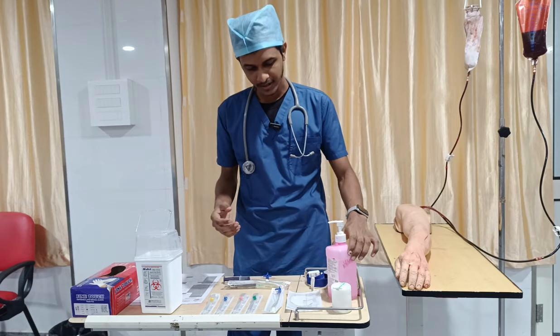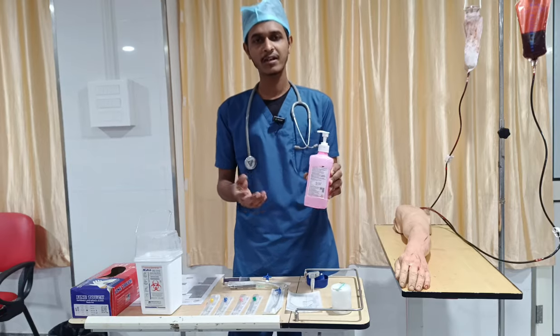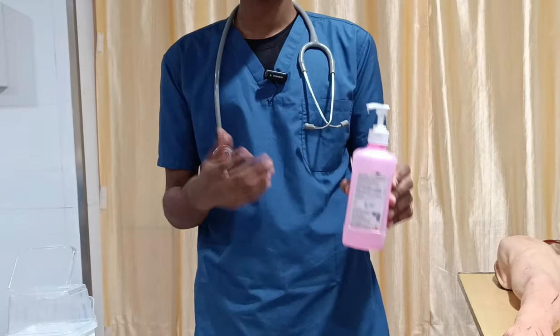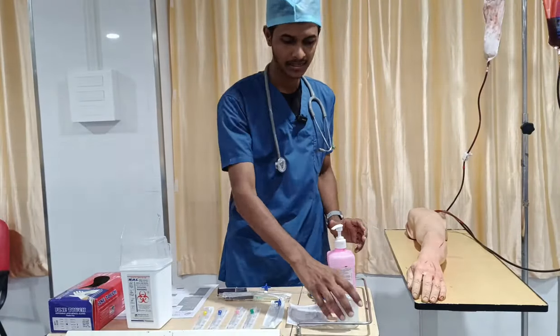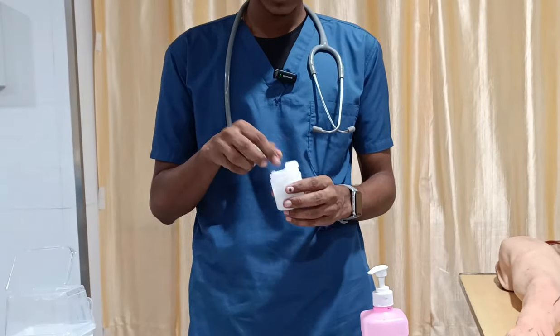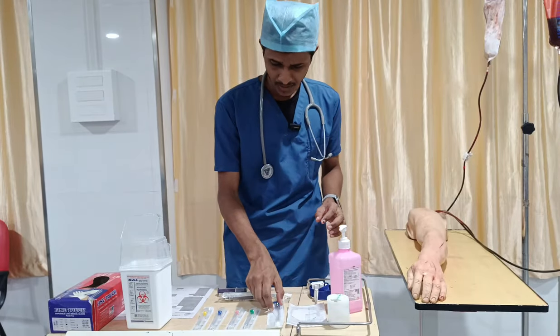Second, you can take an alcohol swab, or if you don't have one, you can take chlorhexidine or alcohol hand rub. Then here I have some cotton to clean and sterilize the area. And then I have cannulas.